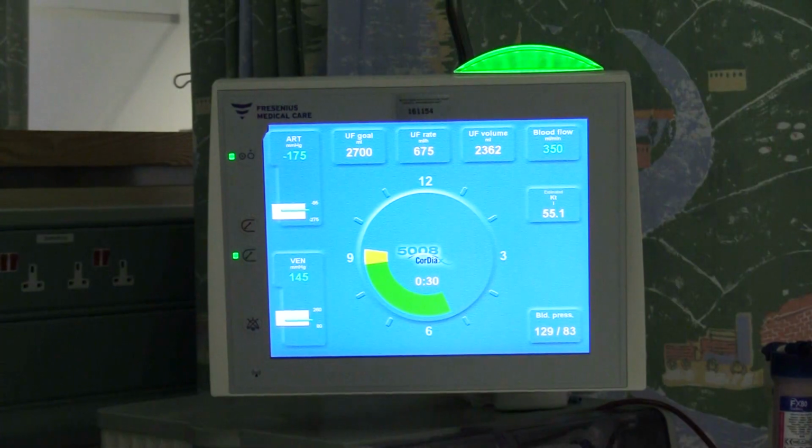The patients turn up for their dialysis session, or appointment as we sometimes call it, and we do some baseline blood pressure monitoring, a heart rate, temperature, and where appropriate we do a blood sugar, and obviously we weigh patients pre and post procedure. They come for the dialysis.